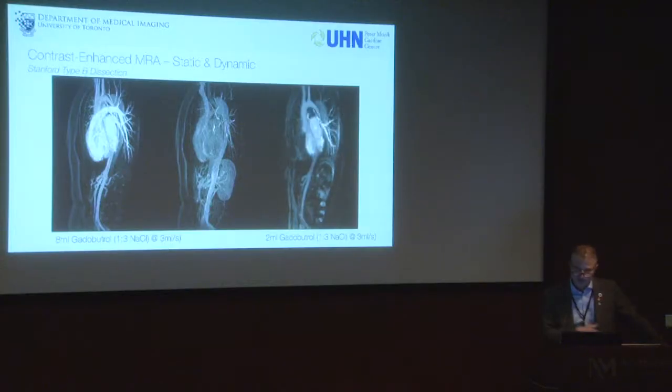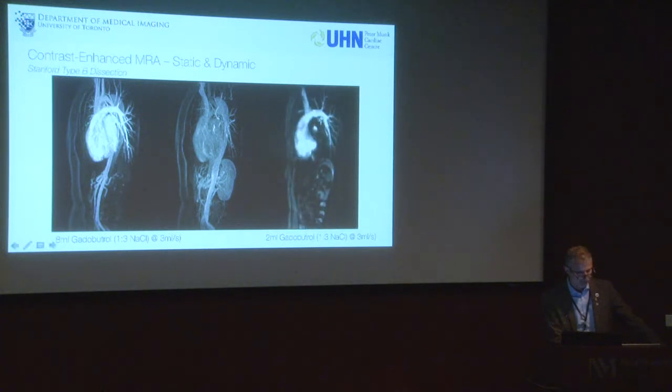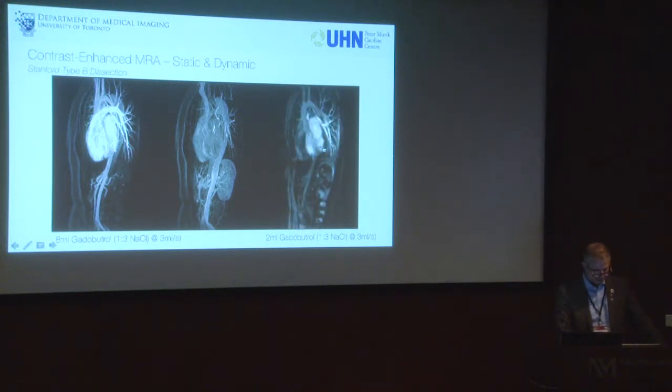And then what we actually do before, so we actually use the dynamic MR angiography as our timing bolus as well. So we thought not going just for bolus triggering, we go for dynamic MR angio, which gives you some information. Sometimes in case a patient cannot hold the breath, it's actually sometimes the only diagnostic image quality series where you can pick a certain contrast phase. And then we get the dynamic information, use this also as the test bolus, and in this case you also see the difference in the filling of the different lumens, which gives you some information, not necessarily flow information, but some information about the enhancement of the different lumens.